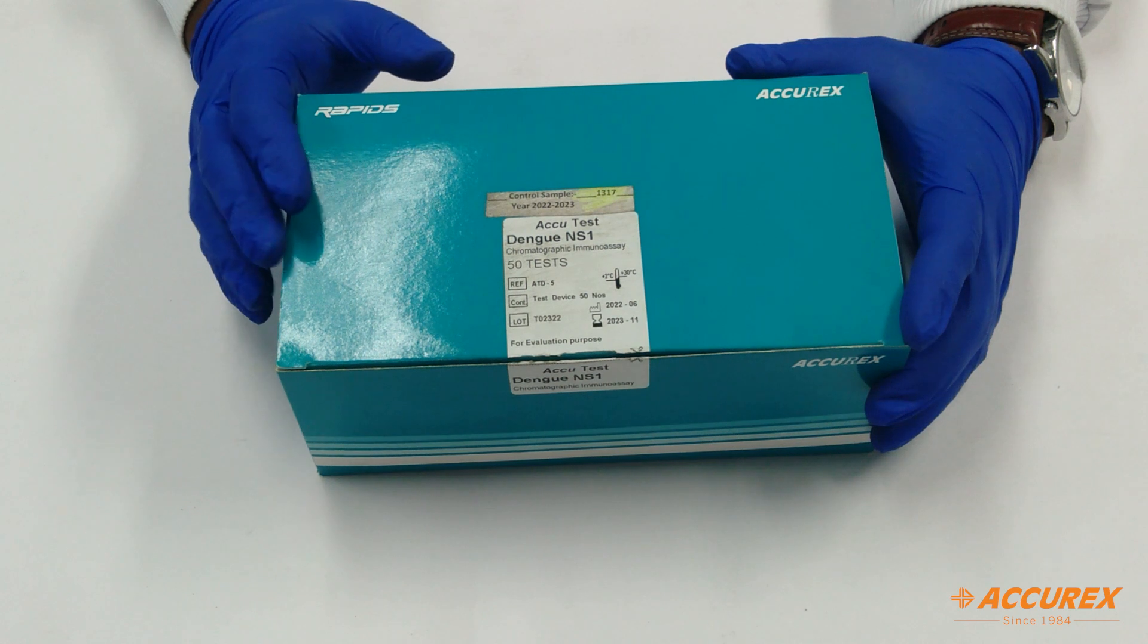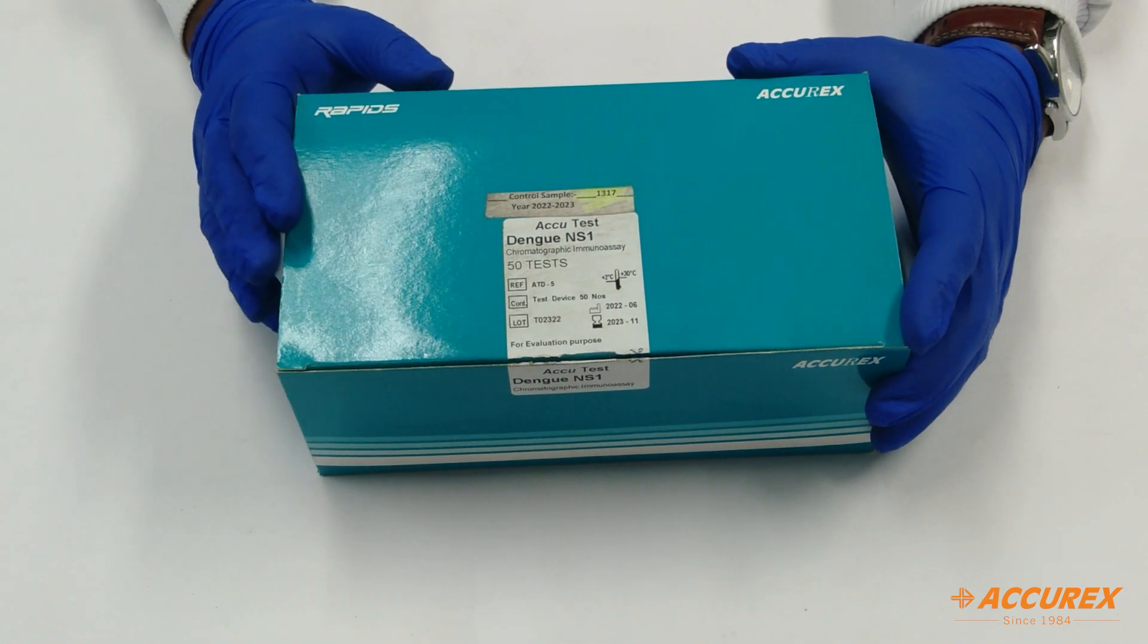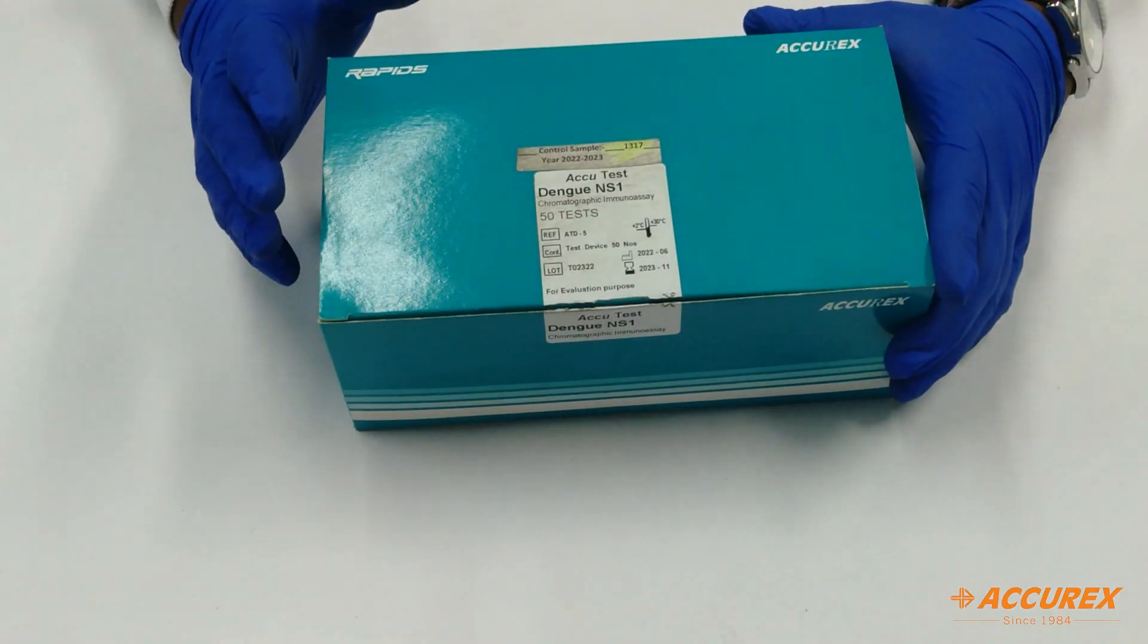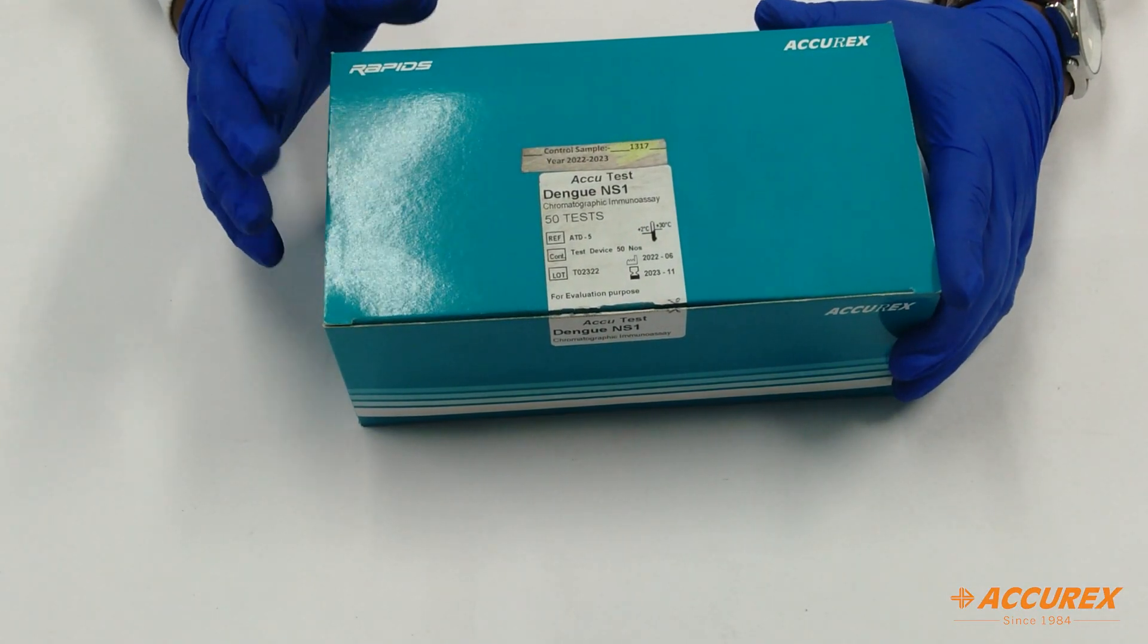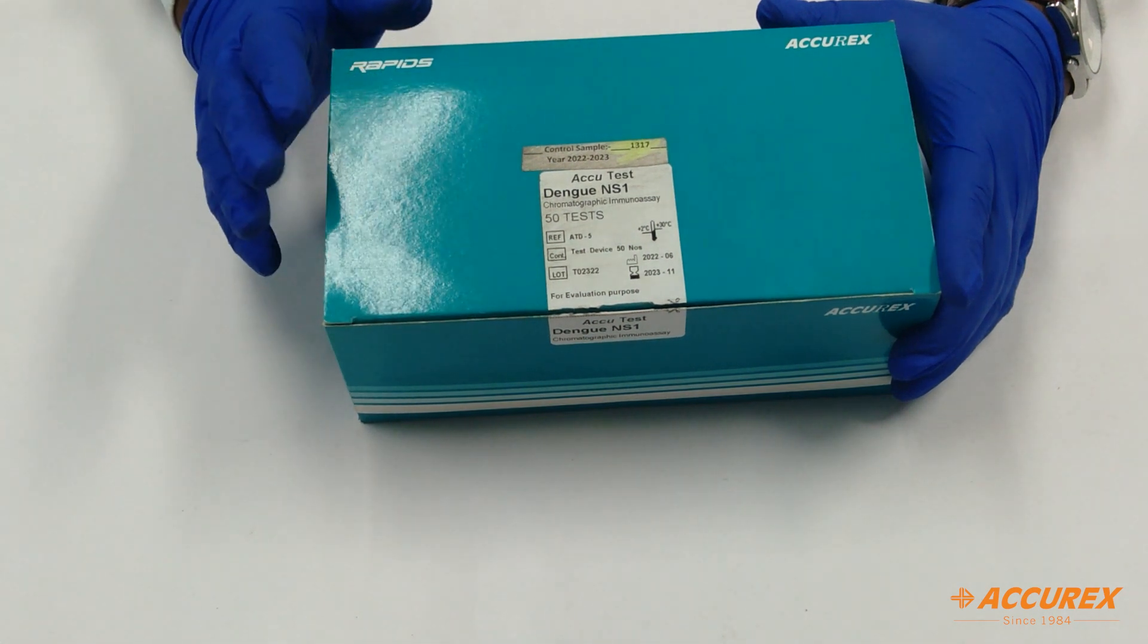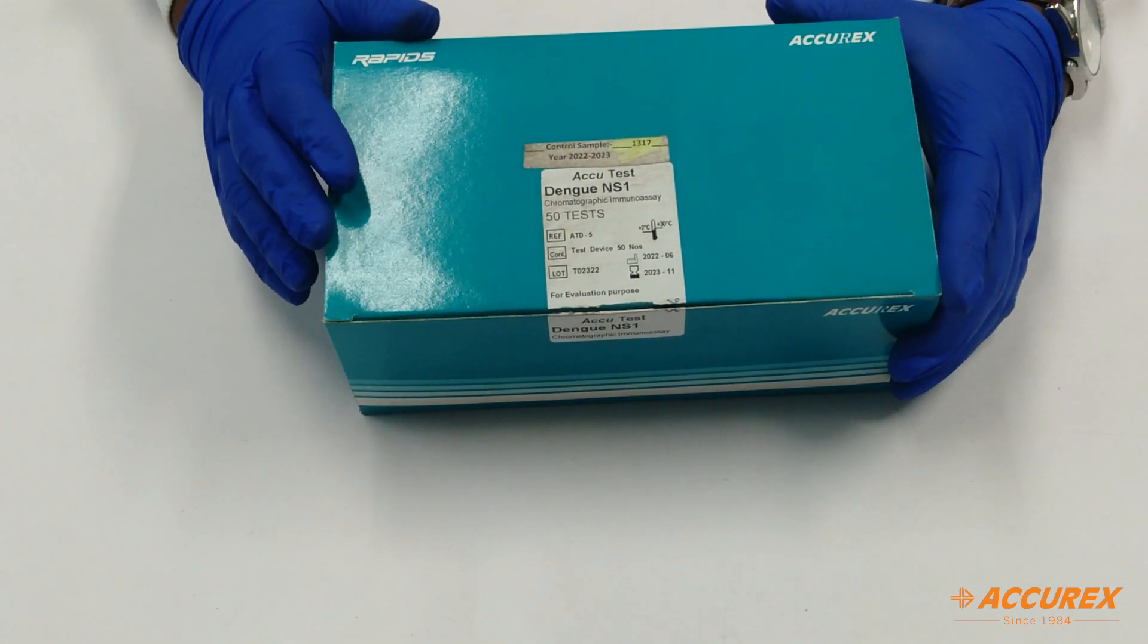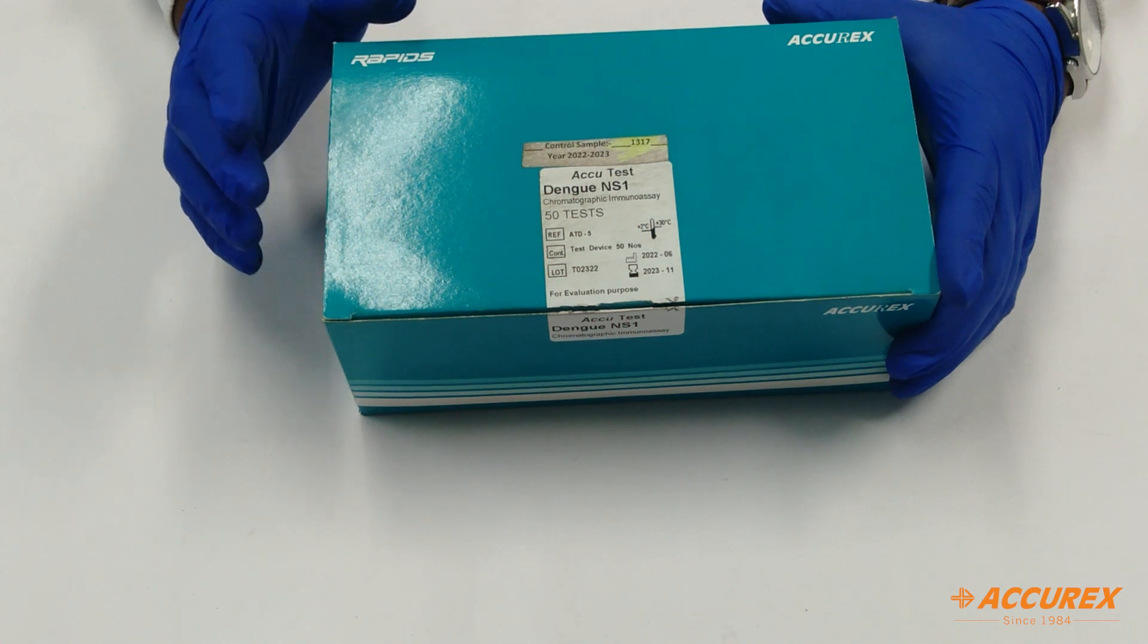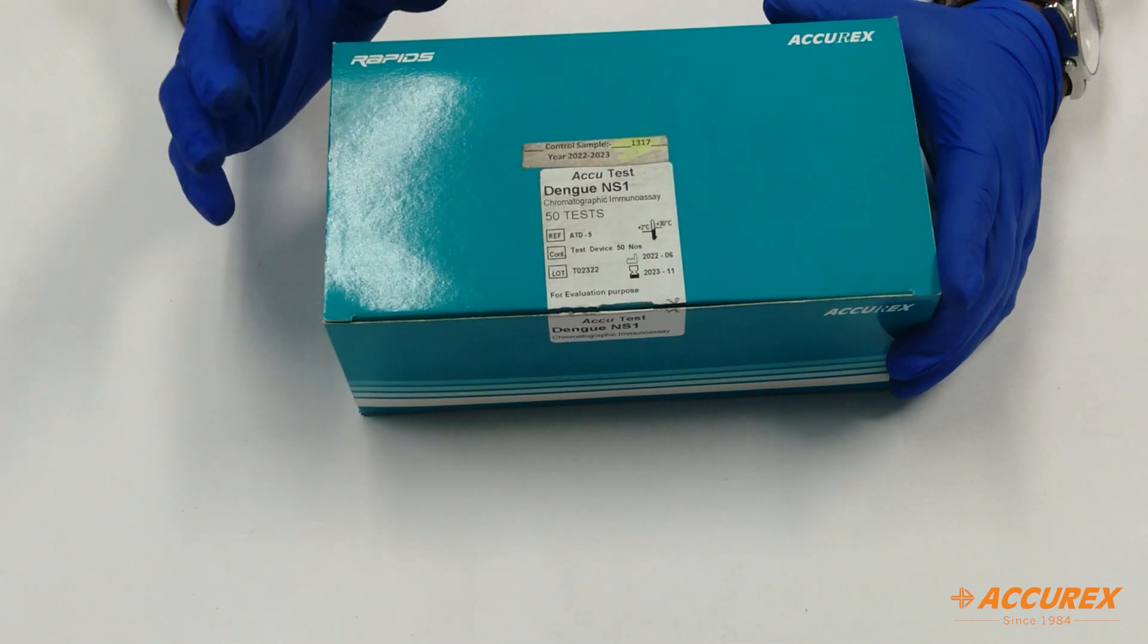For precaution and handling, you need to store this kit at 4 to 30 degrees Celsius. Make sure you don't use the kit or pouch if it is found broken, damaged, or leaking.